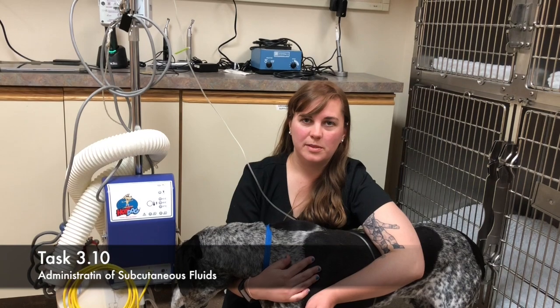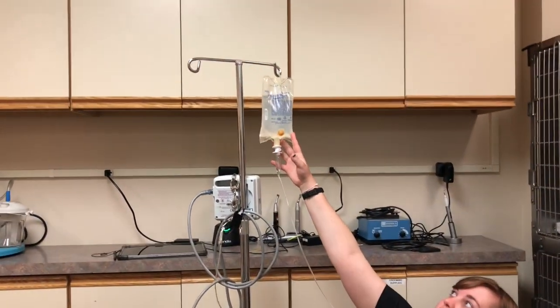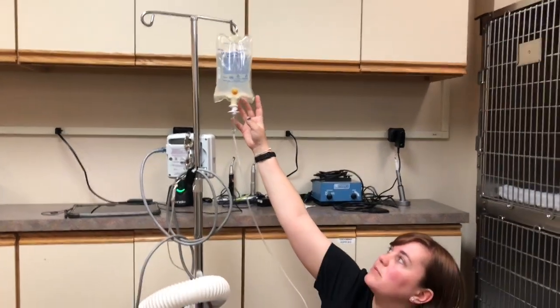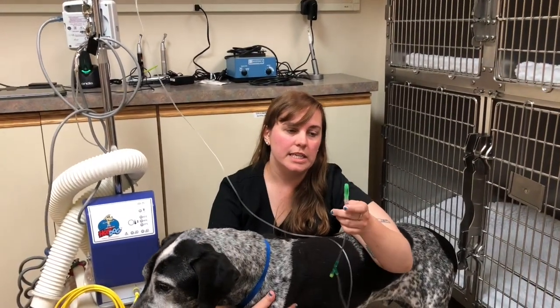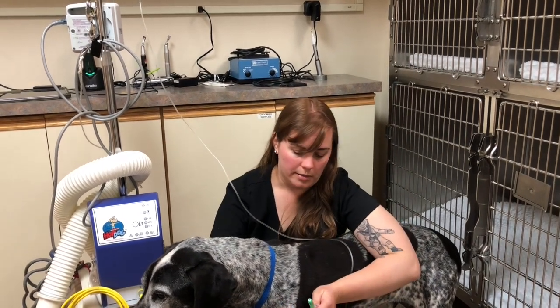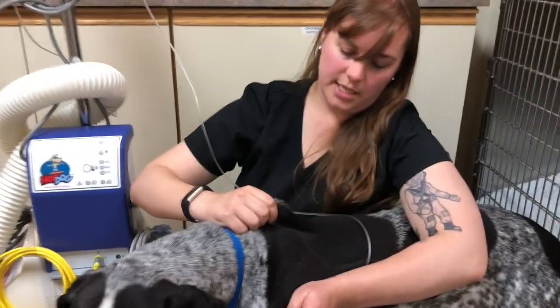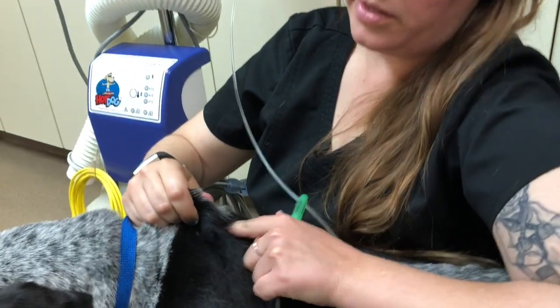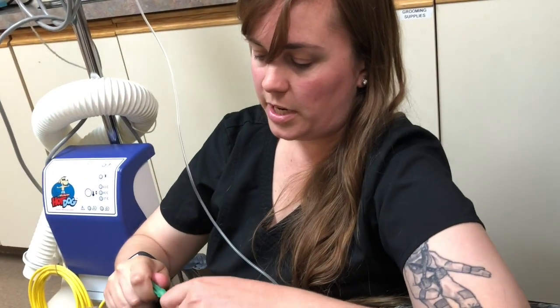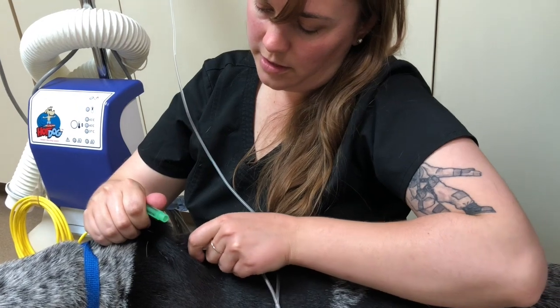So I'm going to administer subcutaneous fluids to Austin here. I have my 500 milliliters of lactated ringers ready with an administration set primed and ready to go, and a brand new 18 gauge needle on my end here. So what I'm going to do, I'm going to tent his skin like so, and then that way I can inject right in the middle. I'm not going to hit any muscles or anything. Bevel up right there in my tent.